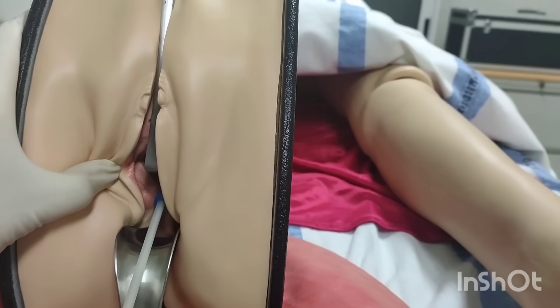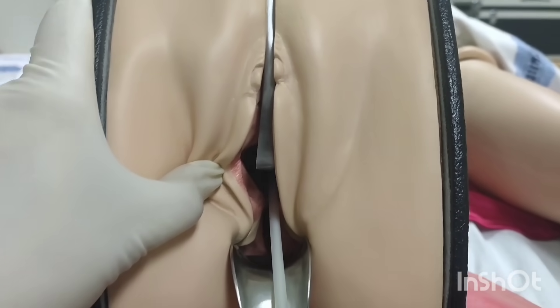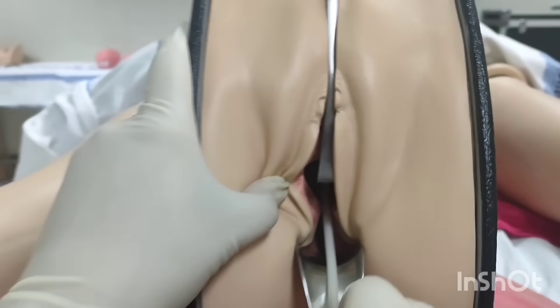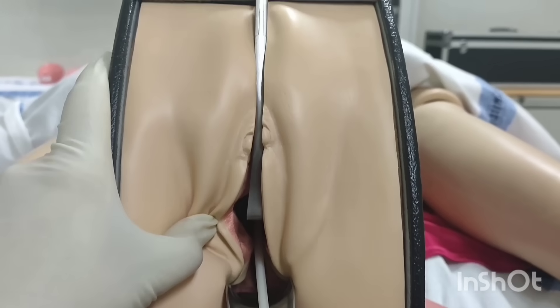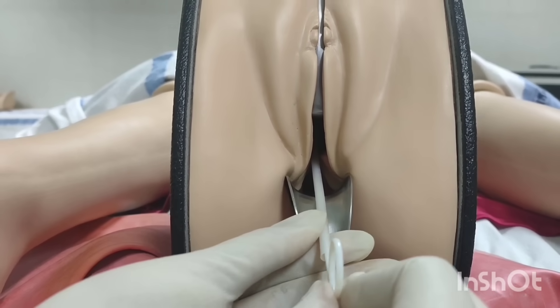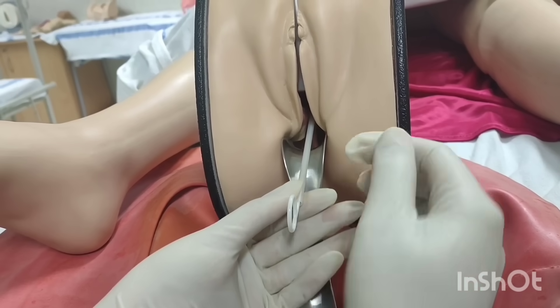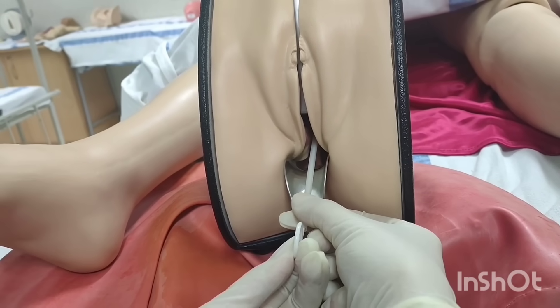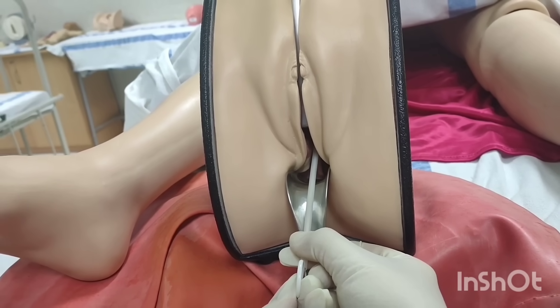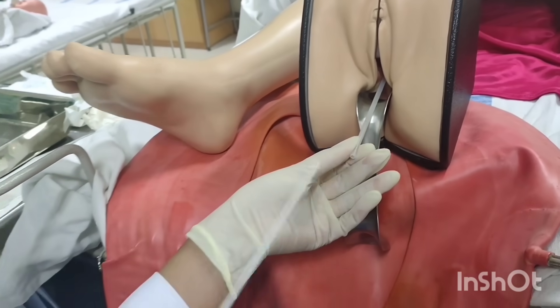Visualize the cervix, and by visualizing the cervix, push the copper T until the stopper touches the exterior os — the lip of the cervix. Then push the plunger inside, pull it out a bit, and then pull it outside completely.